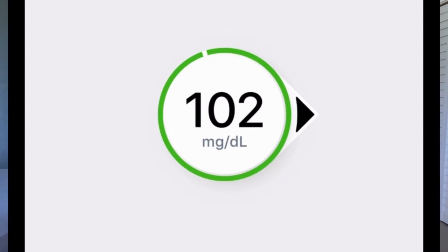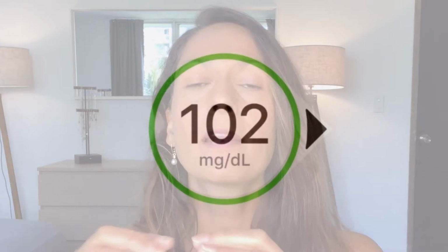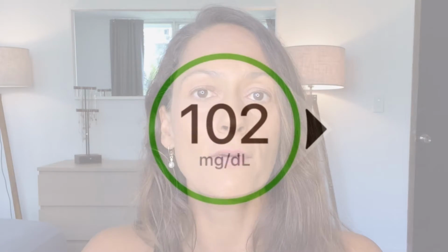When you open your Dexcom app or look at your receiver, one of the things that you'll see is your blood sugar, as well as an indication of where your blood sugar will be in 30 minutes. And that indication comes in the form of arrows. If you're looking at your receiver, you'll see your current blood sugar number, and then to the right of that, there'll be an arrow, and that is indicating how your blood sugars are trending. It looks a little different in the app. In the app, you have your current blood sugar in a circle, and around that circle, you have the arrow that indicates how your blood sugars are moving.